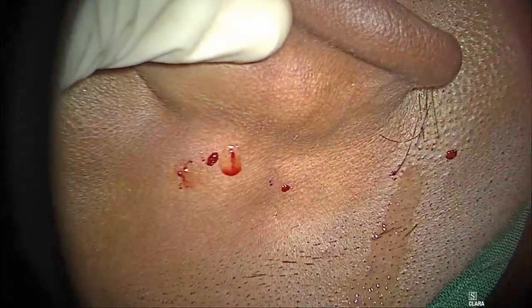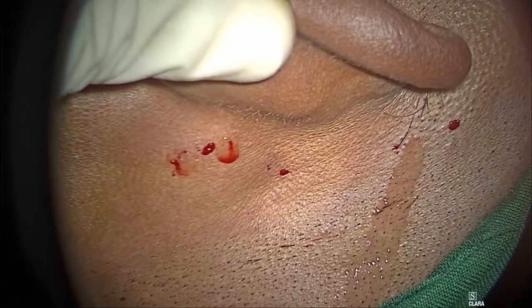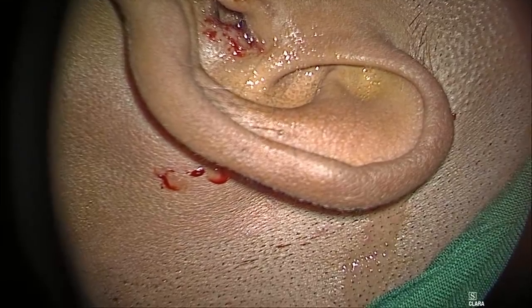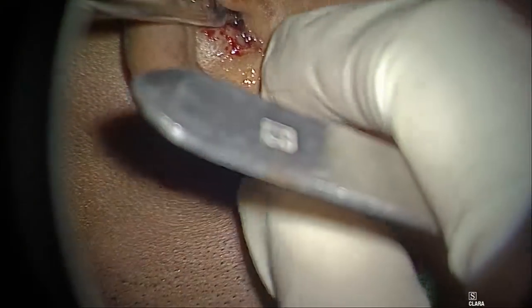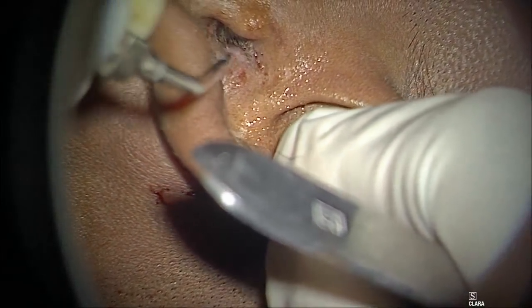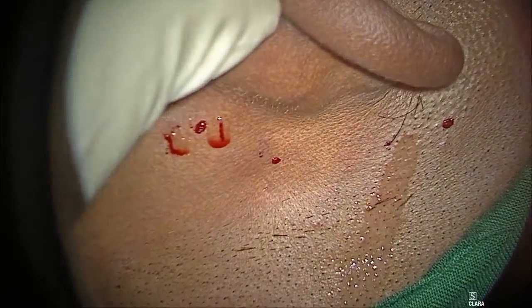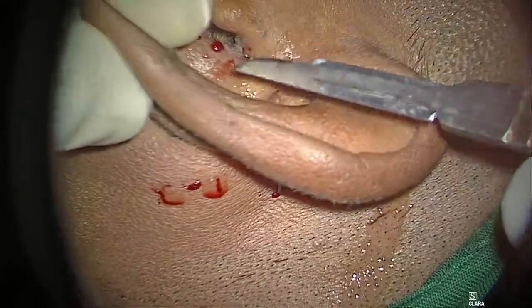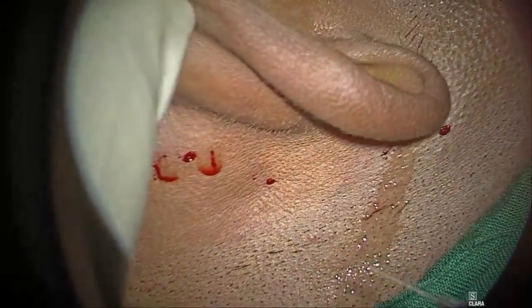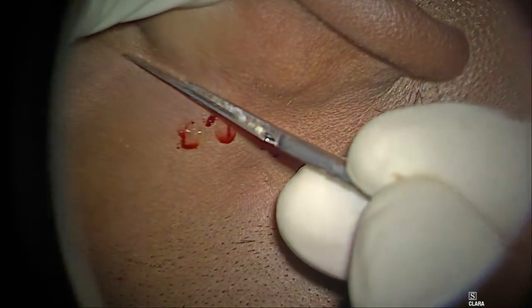Okay, so we are going to start the case. There are various methods of doing it. We can do it with a microscope, we can do it with an endoscope. I generally don't like to do it with the endoscope because one hand is gone, so I do not prefer doing endoscopic ear surgery. In the microscope you can do a postaural incision, an endaural incision, or an endomeatal incision. But here I'm going to do a postaural incision, and you can see that I'm going to start the incision.